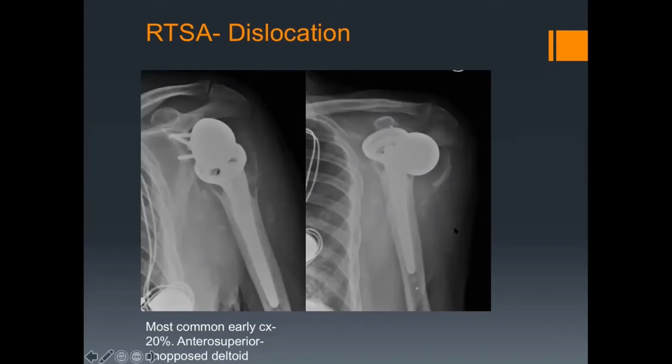Do you have any comments about that one, Dylan? To my mind, there's generally something wrong within the operation if your reverse is dislocated. I've had 3 dislocations in around 120, I think. One was a fracture case where we had a problem cementing the stem, and no cement in effect went down the canal at all, so the whole thing was just twiddling around when we revised it.